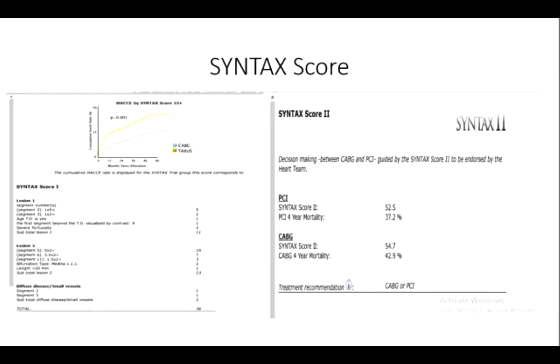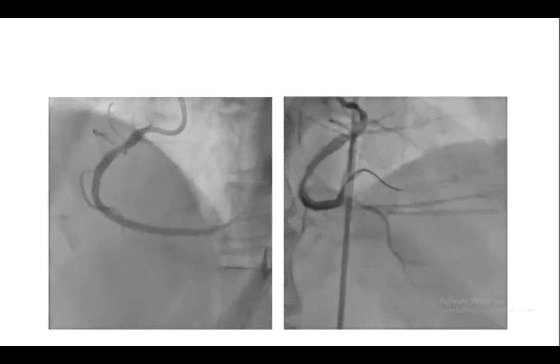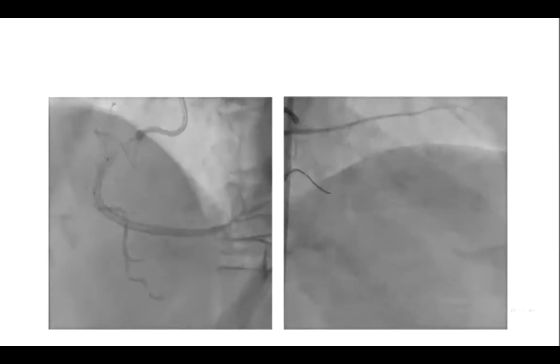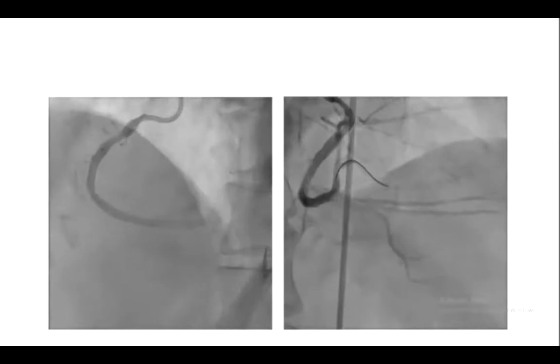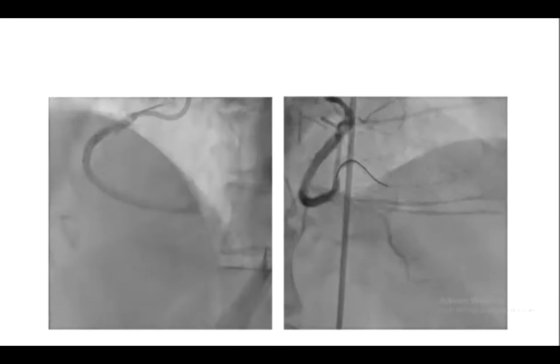We first tackled the RCA on the index day of the angiogram. The CAG as well as the PCI was done with 40 ml of dye. We used VisiPak and we used a Pilot 50 hydrophilic wire with a Fine Cross microcatheter to cross the lesion. And we opened it up, did pre-dilatation, and then we took a single stent and we deployed it. It was two stents actually.